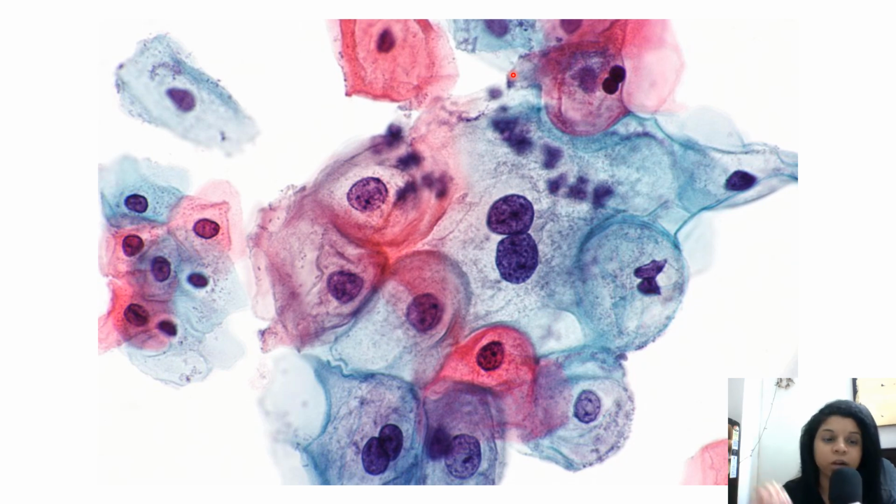So whatever organism is there or not, if you report it, it is well and good for you. It may be helpful for the diagnosis for the clinician or the gynecologist. But if you miss squamous intraepithelial lesion, it is much more of a crime than missing a trichomonas in the slide.